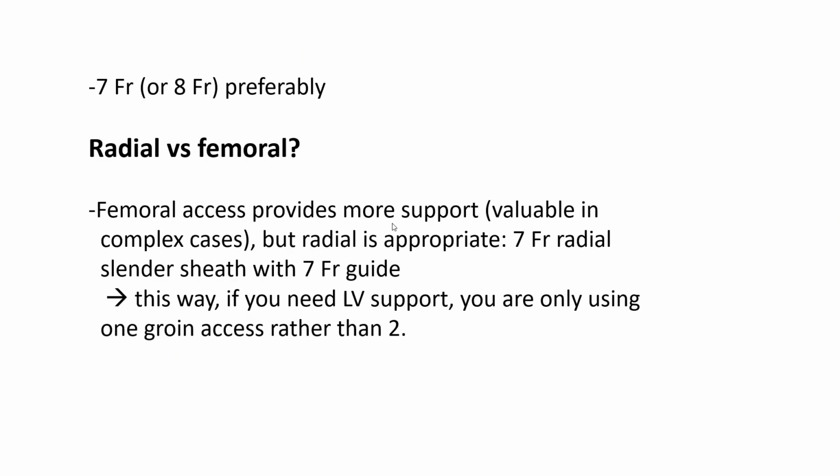Other questions regarding access: we generally prefer 7 French guide instead of 6 French. 1, because it provides more support, and 2, because in distal left main stenting, you may need to do simultaneous stent and balloon inflations 3.5 millimeter or more in diameter, especially with the tap and T techniques that I will describe a little later. Sequential crush, DK crush, and culotte may be done through 6 French.